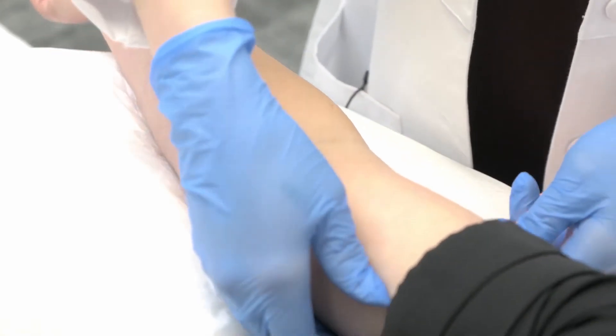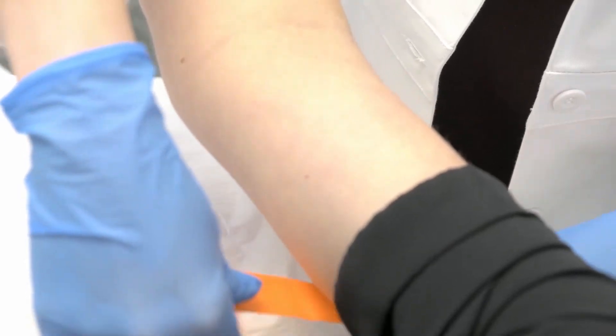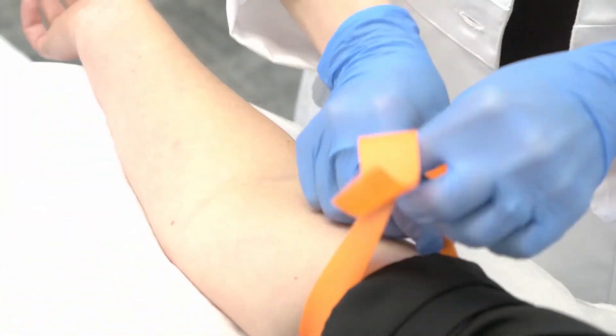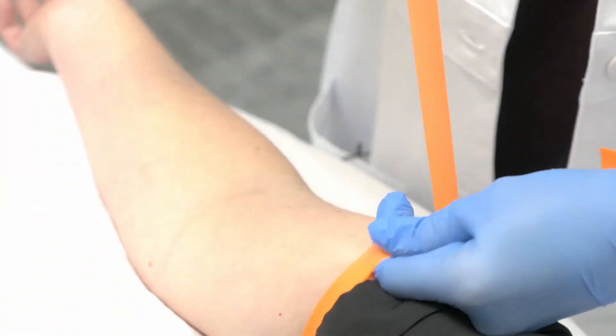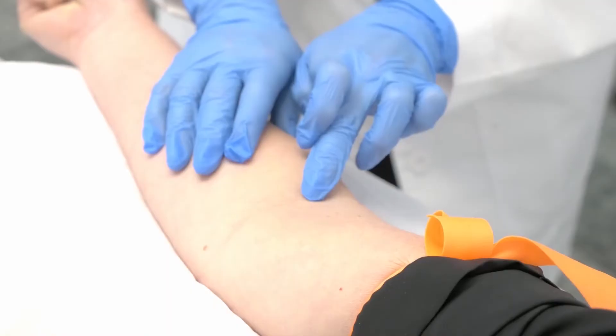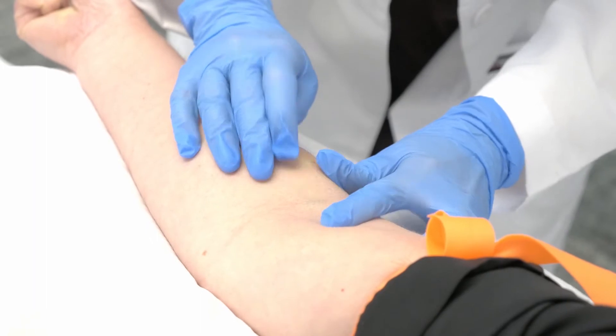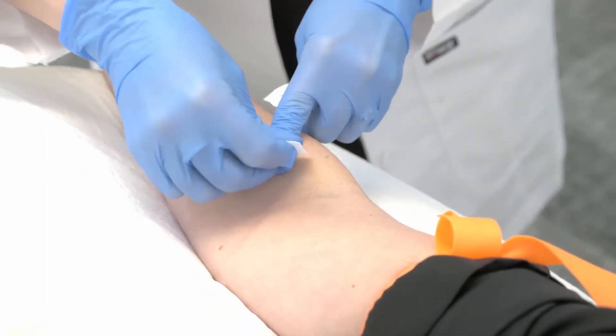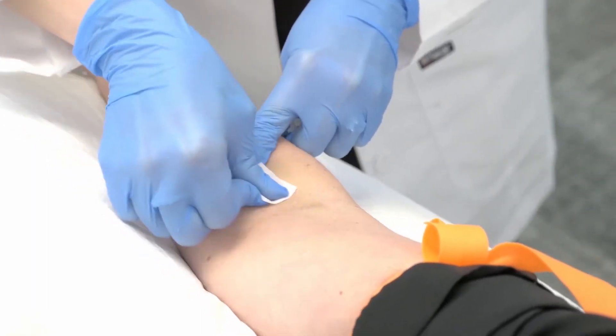Now apply the tourniquet to the patient's arm. Have the patient make a fist. Check for veins in the pressurized arm. The vein will feel like a trampoline. Cleanse the area to be punctured with an alcohol wipe.